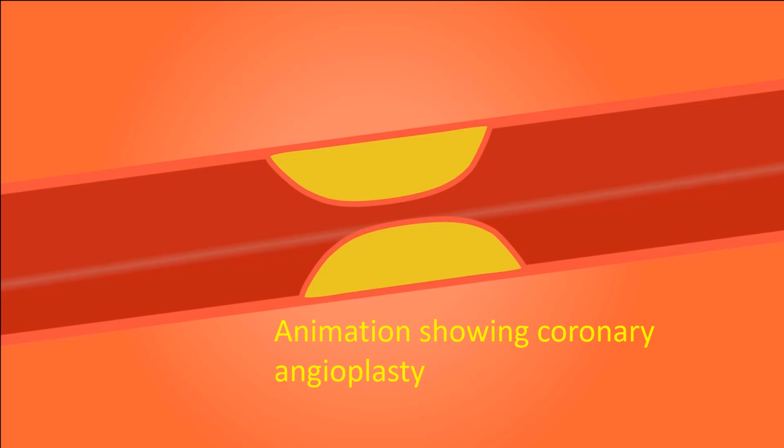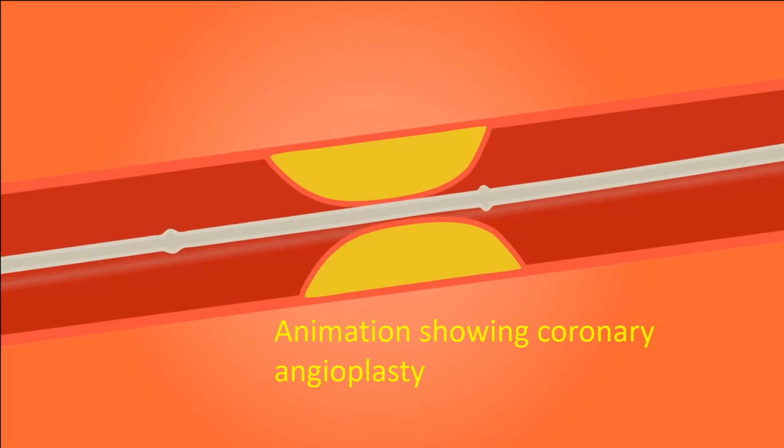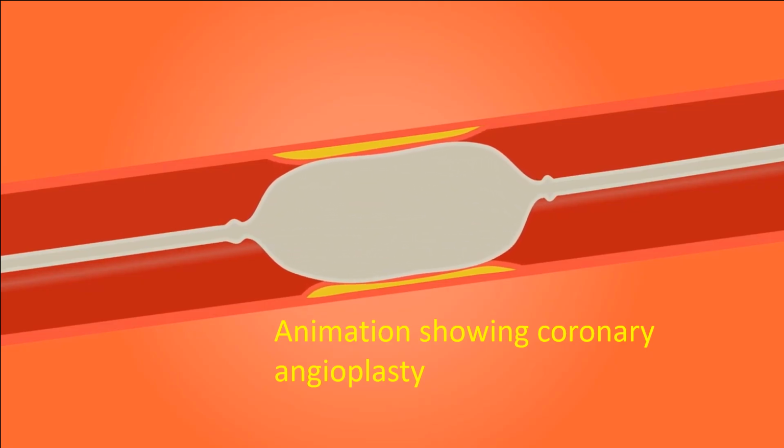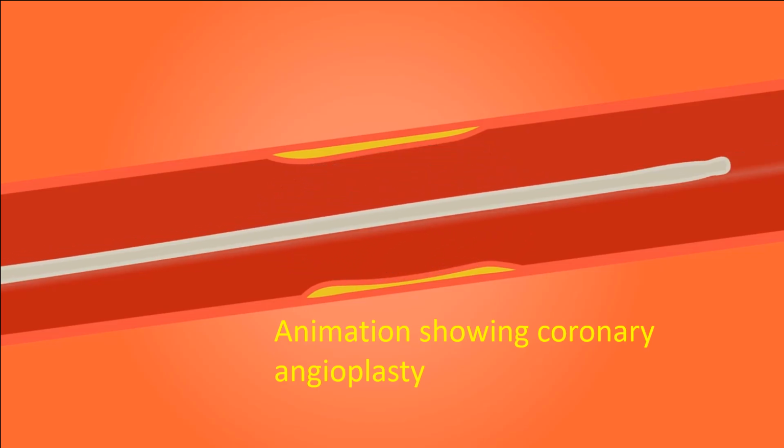With the availability of coronary angioplasty, first preference is now given for angioplasty rather than clot dissolving treatment. Coronary angioplasty is the procedure of removing obstructions in coronary artery using balloon catheters introduced through the radial or femoral artery. Balloon catheters are guided to the coronary arteries through larger catheters known as guide catheters under fluoroscopy.